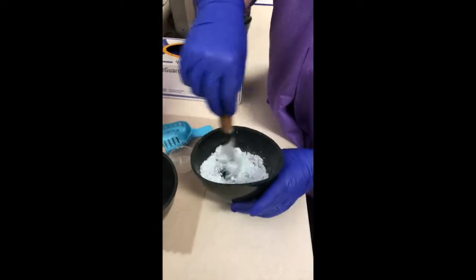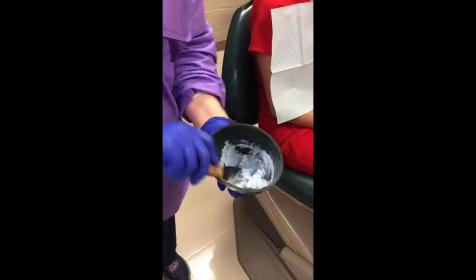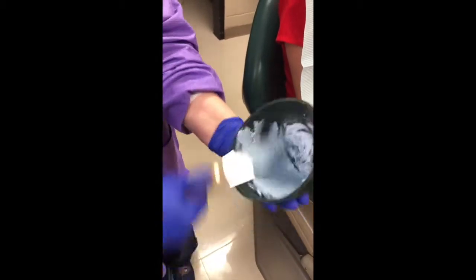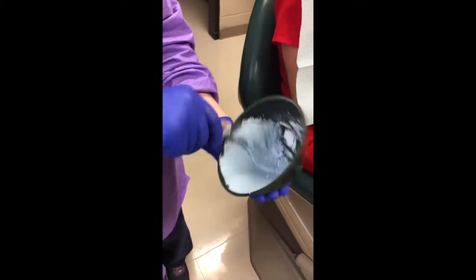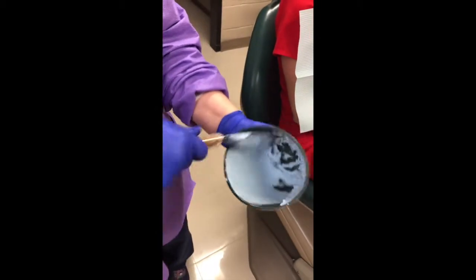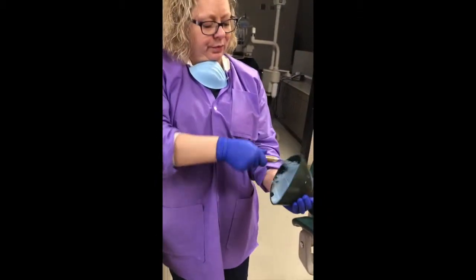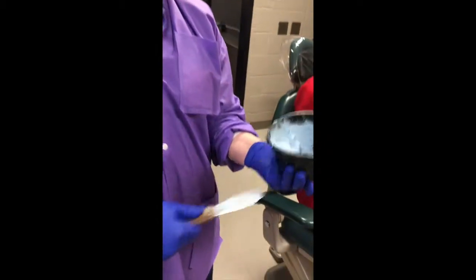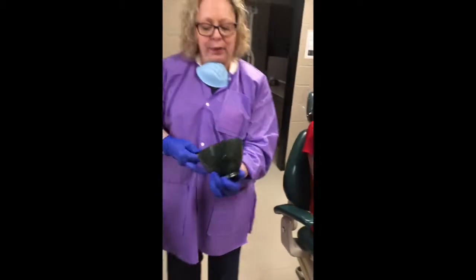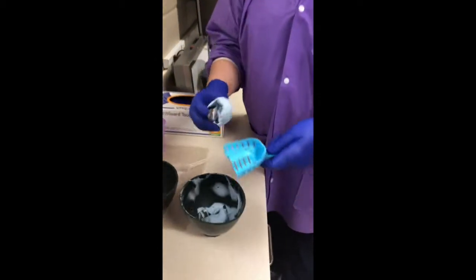And I'm going to stir it just a little to begin to get it mixed, and then you turn the bowl on its side and start to push that material along the side of the bowl to mix it smoothly and get all of the powder mixed into the water correctly. Because when you seat it in the tray, if it's not properly mixed, it'll affect your impression, right? Because we want an exact replica of the tissues inside the mouth.